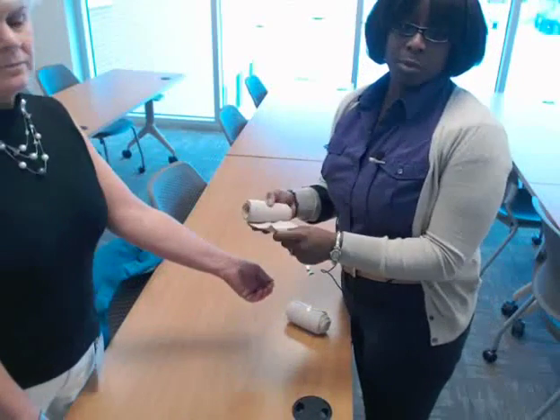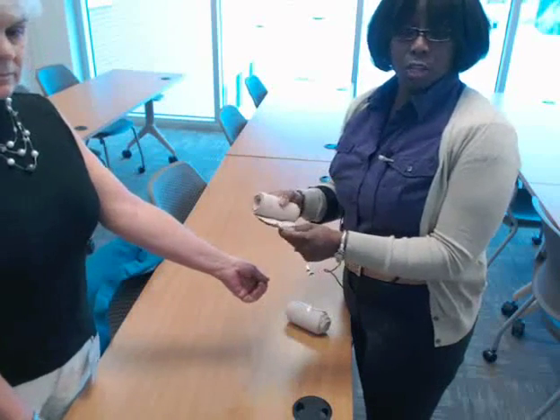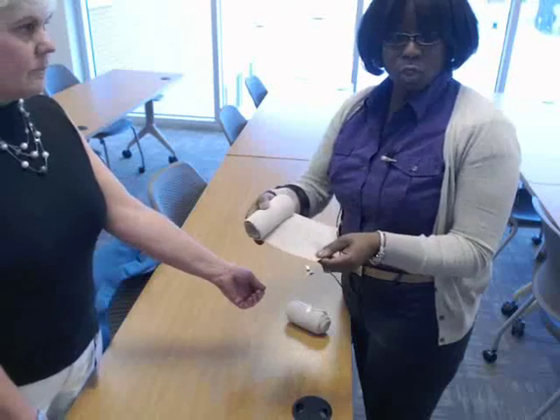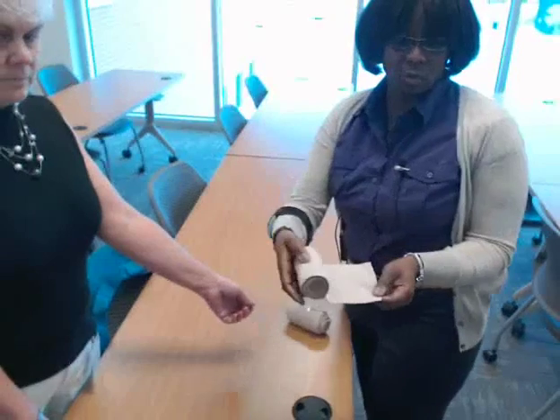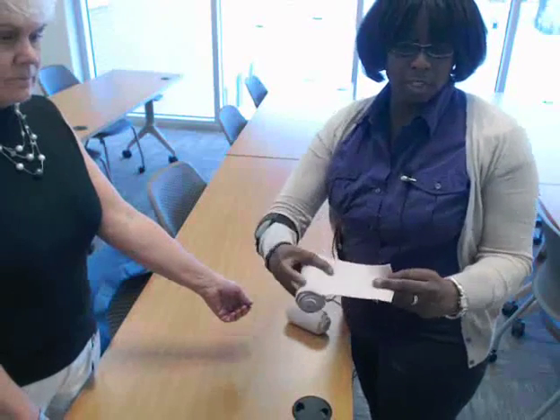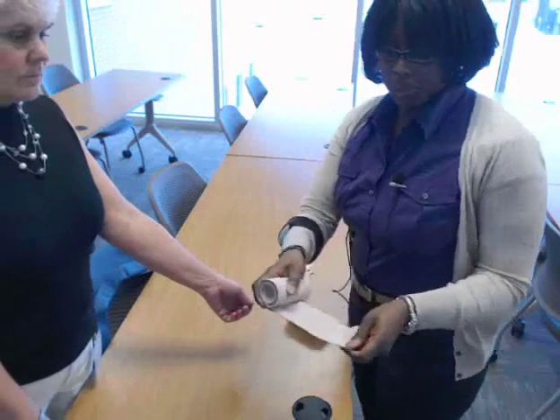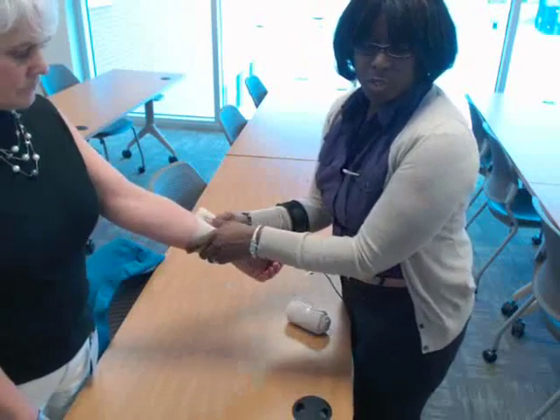When you're doing wound care, sometimes we have to wrap with either the gauze wrap or an ace wrap. You want to hold your gauze wrap or your ace bandage wrap just like this with your roll up. You don't want it underneath because this will give you better control of your roll. Any wrap that we do, we want to start with circular turns.